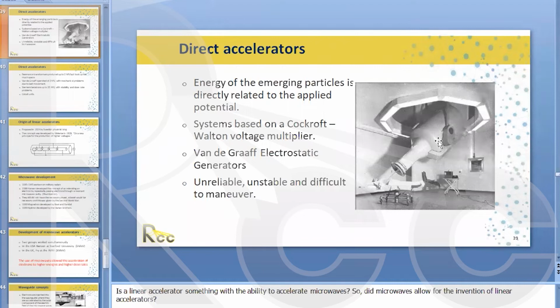But orthovoltage, superficial, always gave maximum dose to the skin. It wasn't until Cobalt that we really started to see skin sparing. A half a centimeter doesn't sound like much, but it helped a lot with keeping skin burns to a minimum. The early treatments were limited because they gave maximum dose to the skin, and also because they were not in the megavoltage region. They were always like 200 kV or less.